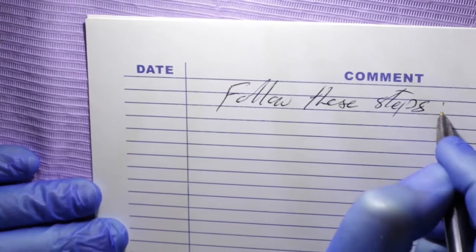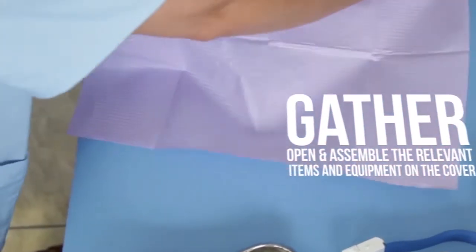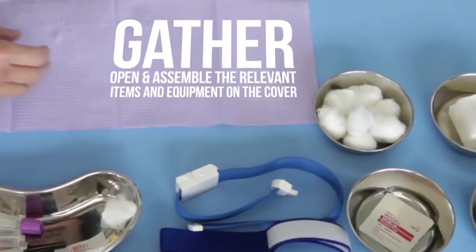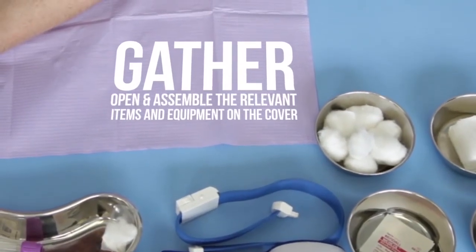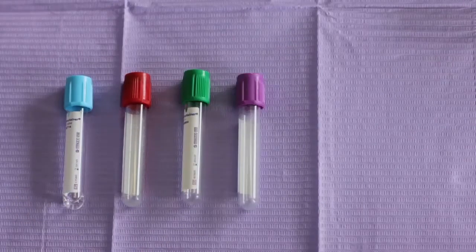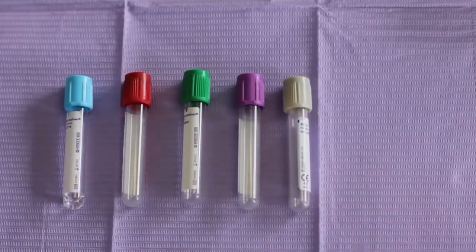Now follow these steps. Open a clean work surface cover, then gather, open, and assemble the relevant items and equipment on the cover. Set all of the tubes you need in the correct sequence for drawing the blood.